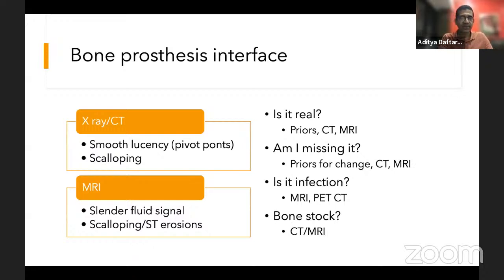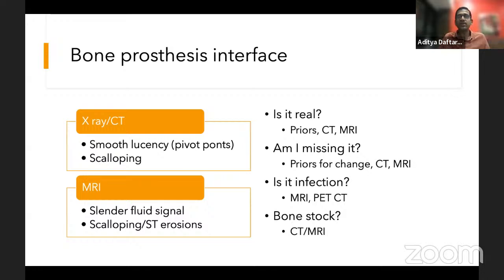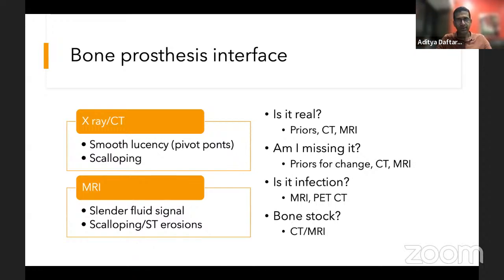On MRI, membrane formation appears as a slender fluid signal area, and osteolysis appears as scalloping. When I see these findings, I ask: is this real — comparing to old images helps, as a new or growing lucency is concerning. I look for whether position has changed. If the patient is painful and I'm not seeing anything on X-ray but am concerned, I consider CT or MRI.